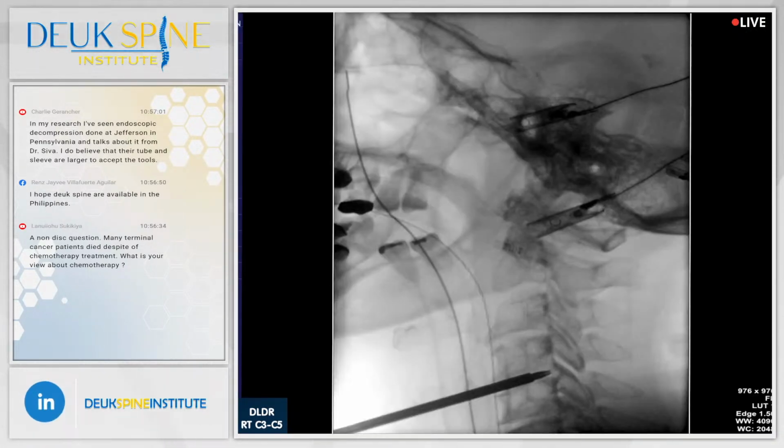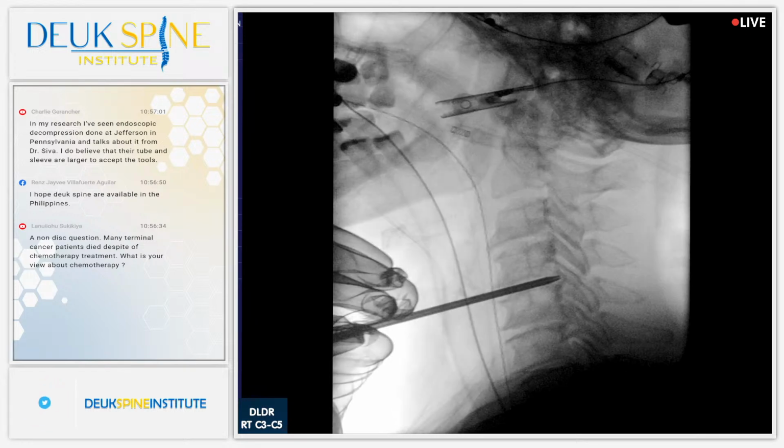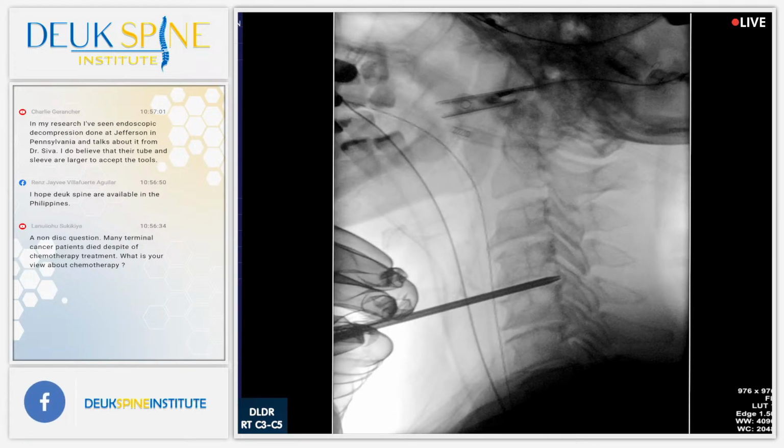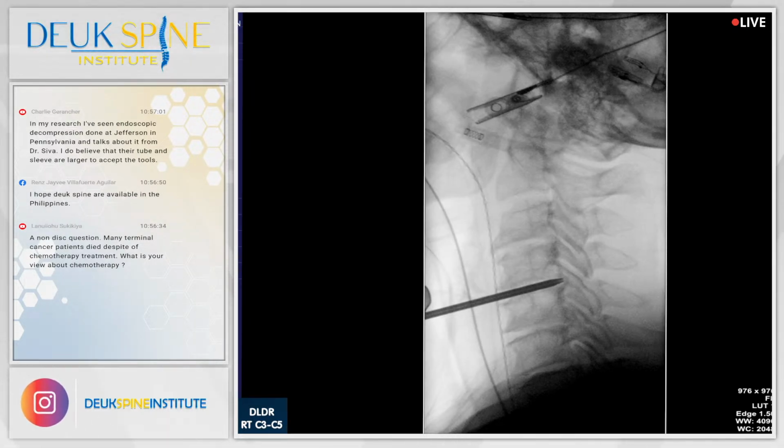No, I don't think we do. The neck is pretty thin. All right, we are done with one, getting ready to do the second disc. I just need the head and shot. Can you please take some of the front away there, Jordan? I shouldn't have to tell you that. All right, 2, 3, 4 is next. Everyone agree? Let's rock and roll. Here we go. I'm coming out.